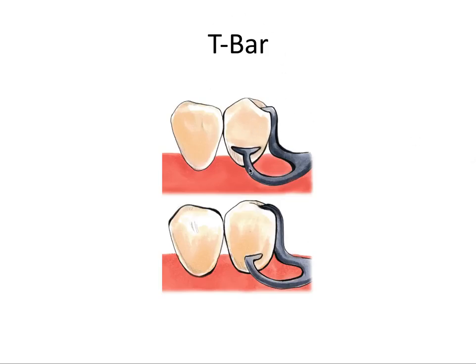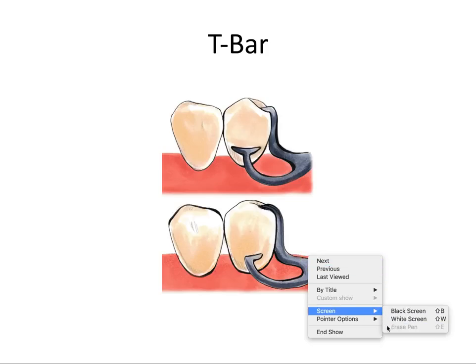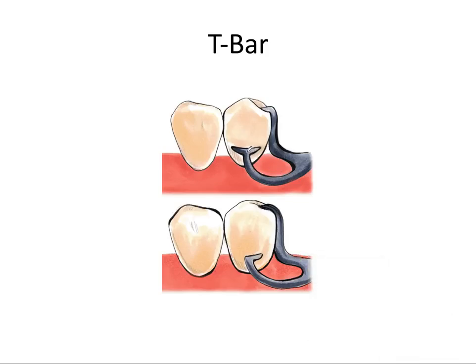So this one here is the T-bar. This one is the modified T-bar or the R-bar design. And it's basically just because of how they look. You can see this one sort of forms a T. This one sort of forms this lowercase r. So here are two infrabulge clasp designs. Again, they originate below the survey line, below the height of contour of these teeth.